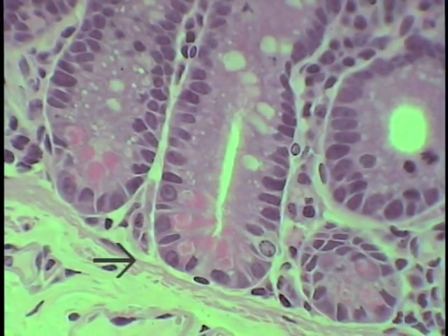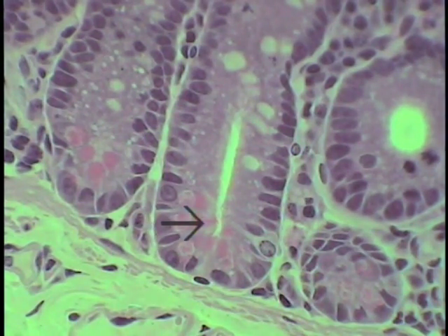This particular field represents the bases of the intestinal glands or the crypts of Lieberkuhn, another one shown here. What this particular field illustrates is Paneth cells, the pointer is now on the nucleus of a Paneth cell, the apex of which is filled with these orangish-red granules. Another one shown here, another one here, another one here, another one here.